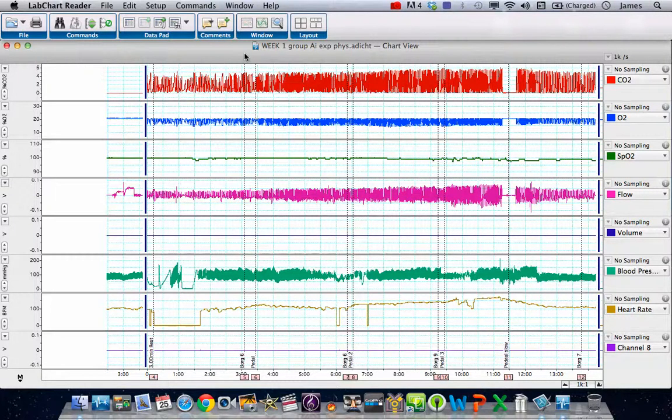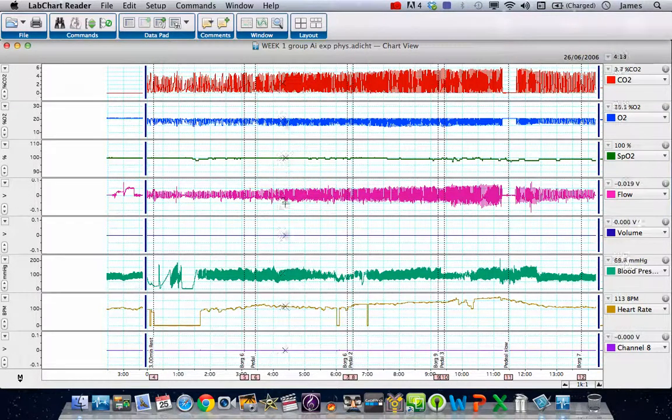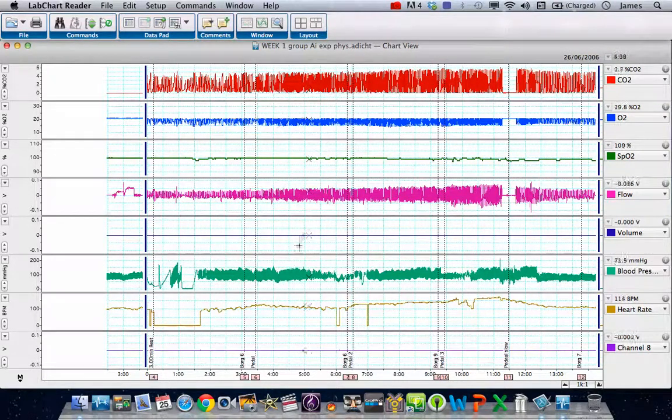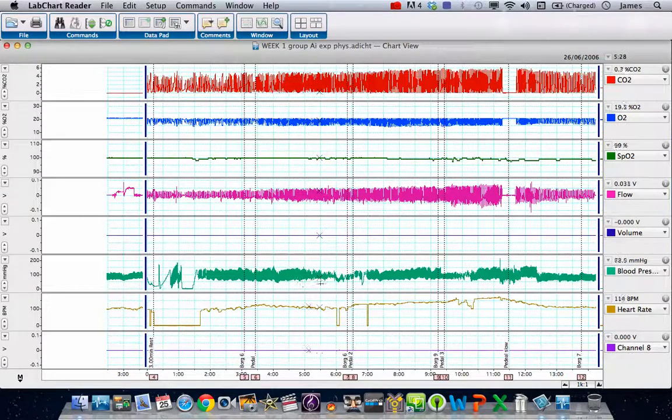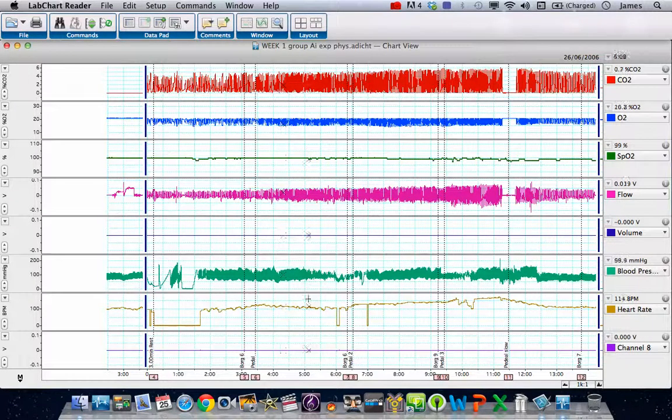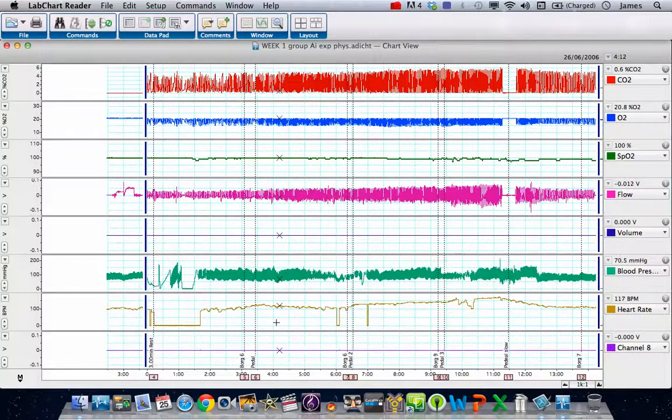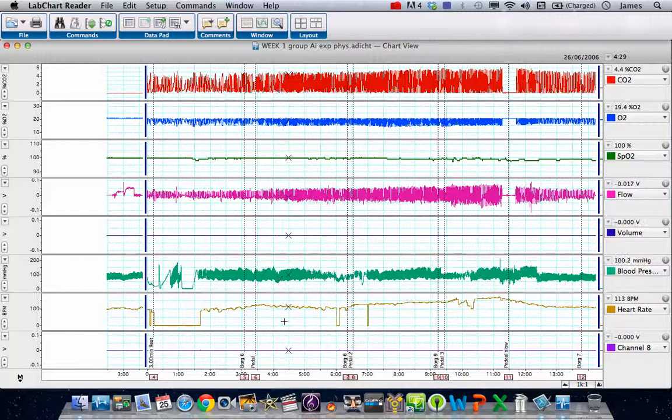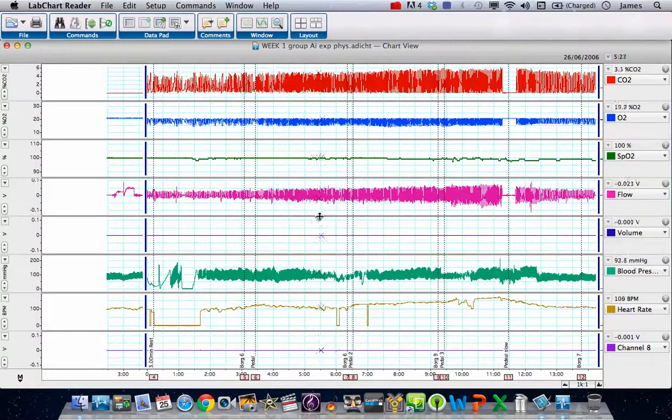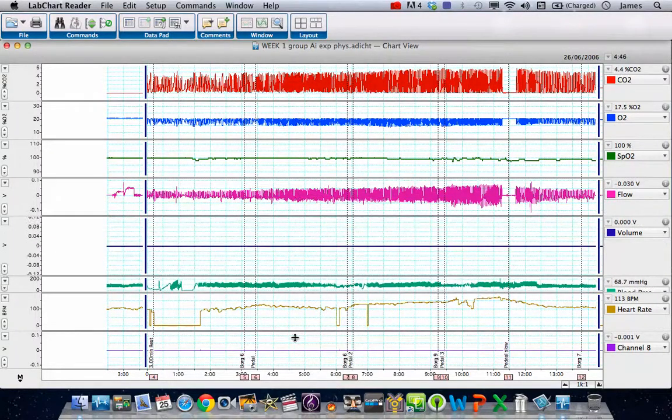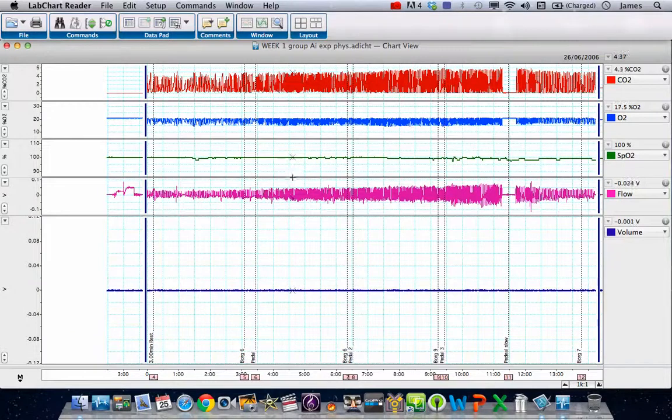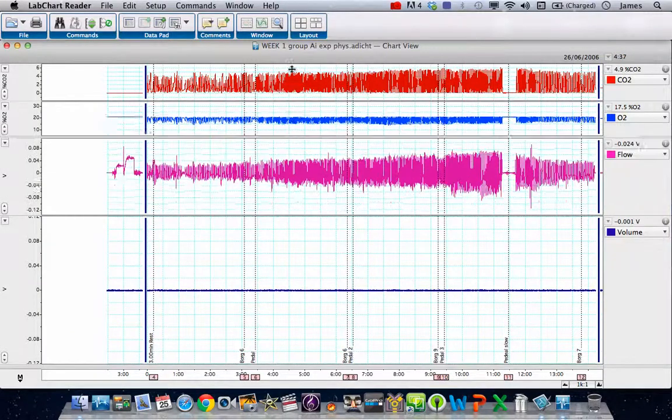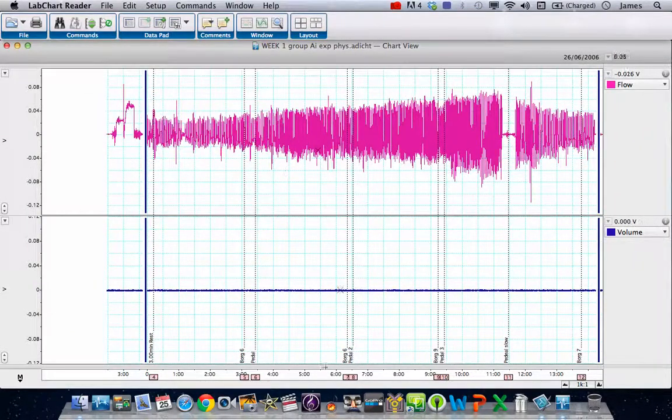This is quite a complicated practical where we've got CO2, O2, SPO2, flow and volume from the spirometry pod, blood pressure from a Finometer which wasn't working very well, heart rate from the Finometer, and then a blank channel at the bottom. For the purposes of this exercise, we're going to hide all the channels we're not interested in and just show the volume and flow.